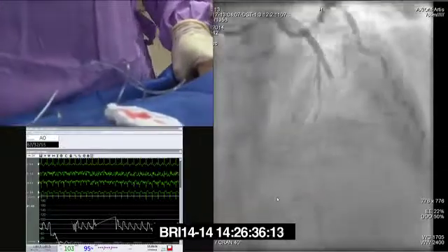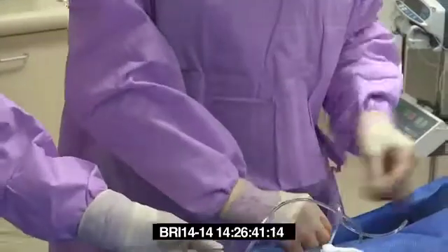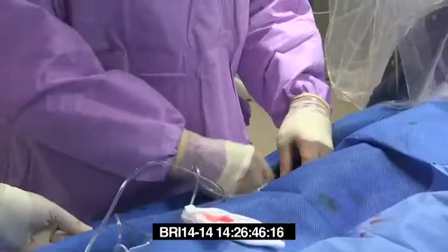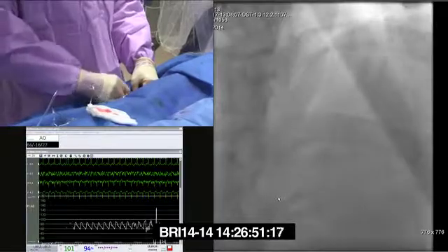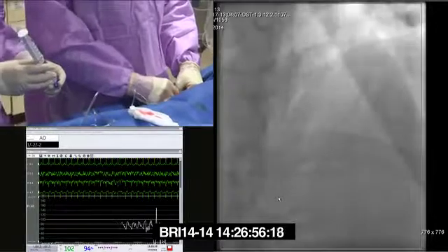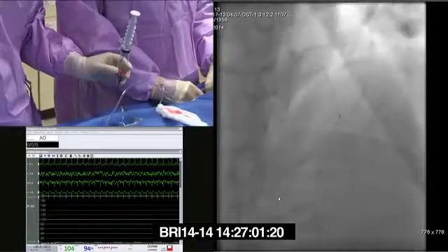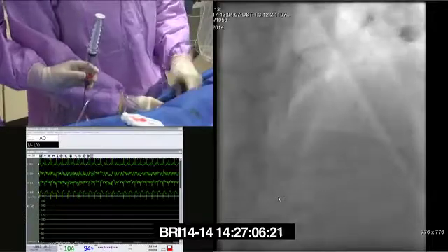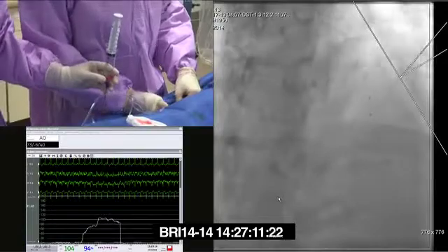1 second. All yours. Thanks. All mine. Okay, so when we see the dots, we're going to go on negative there, please. It was quite tight to cross, so I'll be interested to see if this crosses. Just show me a bit more of the guide. There's no flow in the export. Yeah, we're right on the lesion.